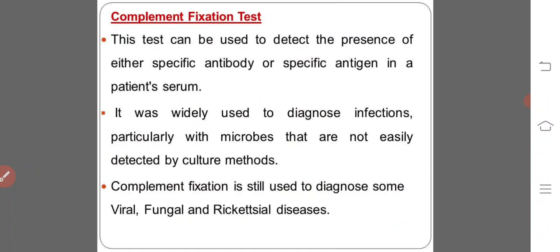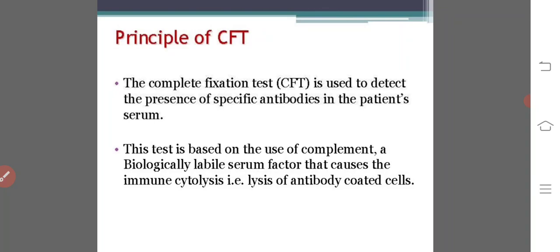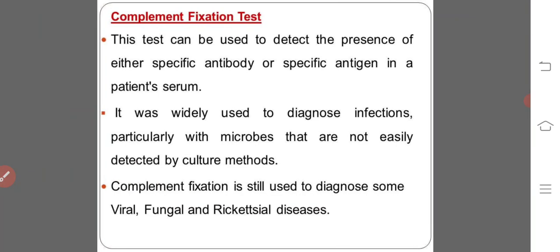Generally, the complement fixation test is based on the competition for complement between various antigen antibody complexes and the lytic system, which consists of red blood cell specific antibodies and red blood cells, which together with complement bring about lysis of RBC. The binding of the complement to antigen antibody complex is called complement fixation. This test is a very sensitive technique used for the detection of antibodies in patient serum.